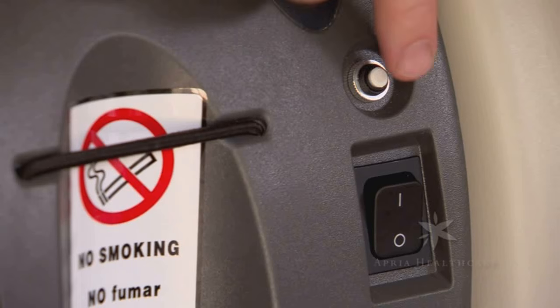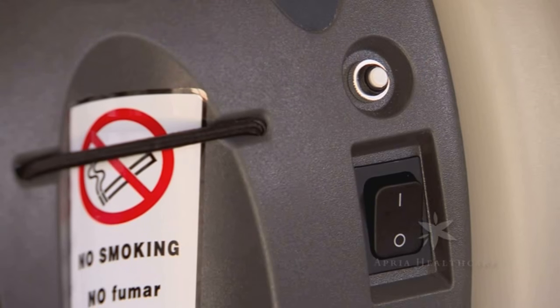In most units, the circuit breaker is a white button located near the power switch. If your unit alarms or stops working, check this first. If you can't locate the circuit breaker button, contact your local Apria branch.